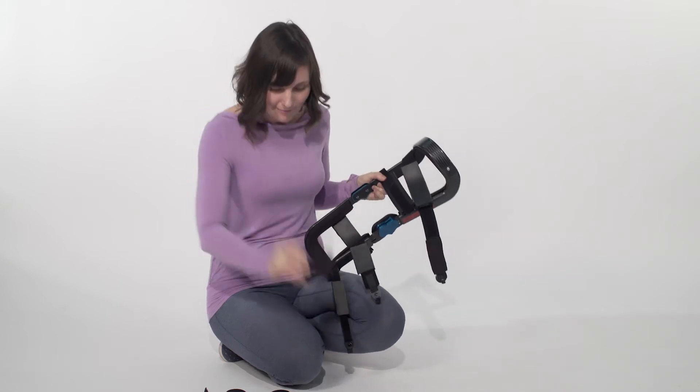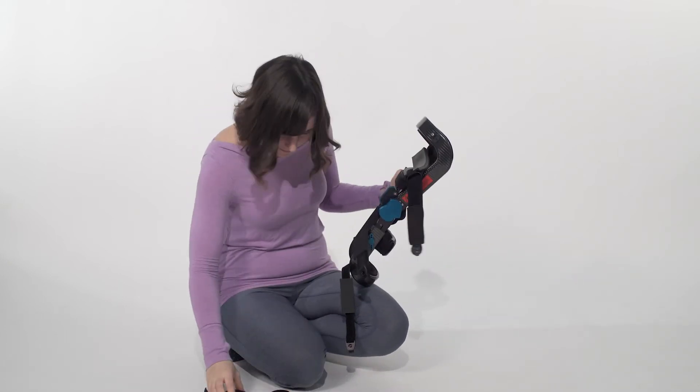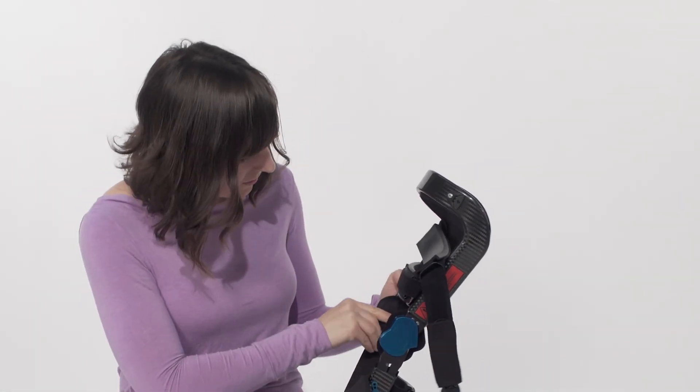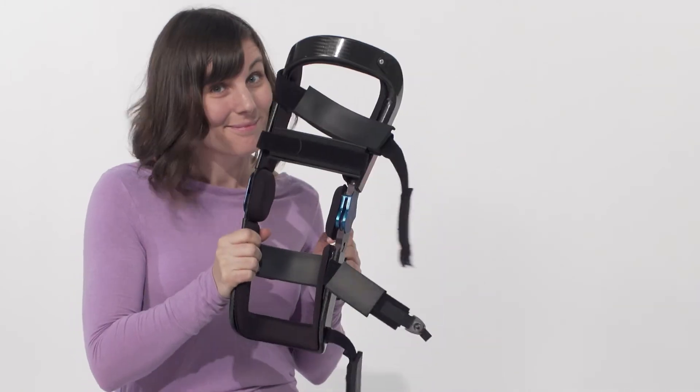A few tips. The condyle pads look a bit like mittens — always put them in the thumbs down orientation. Also, if you center the pad on the hinge you'll have a more comfortable fit.